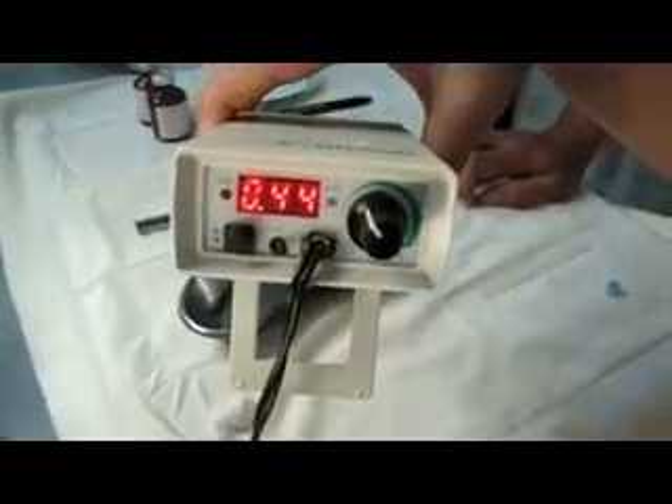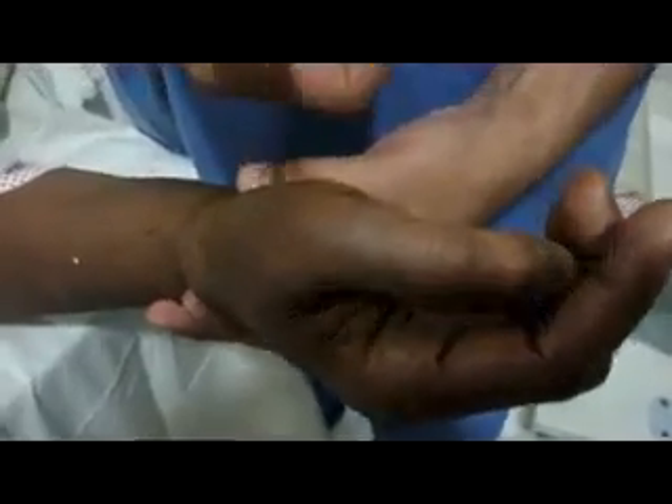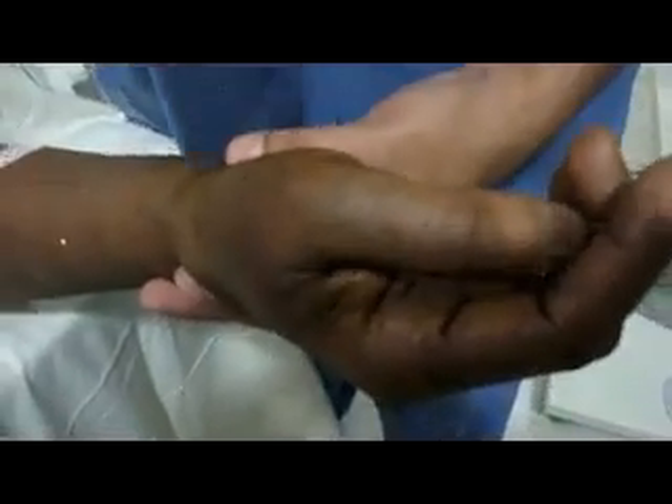Flexion of the fingers. At 0.44 mA we are getting the response. Aspirate and inject. I'm asking her to extend the thumb and fingers — and the response has gone off. This confirms median nerve stimulation and injection.